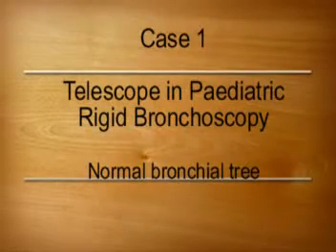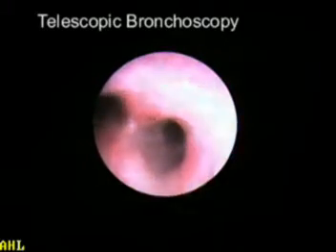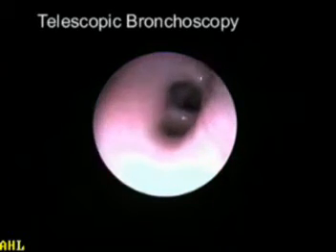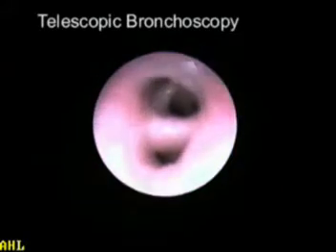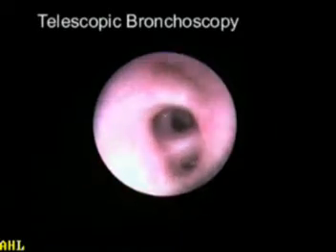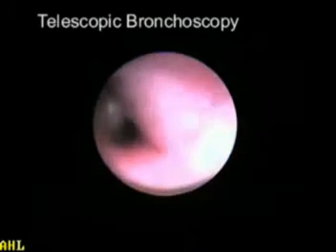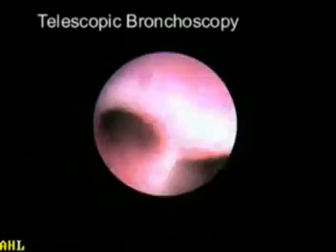A 9-month-old child with respiratory distress undergoes bronchoscopy. The telescope is passed under general anesthesia to inspect the bronchial tree, showing the carina, right bronchial tree, right upper lobe bronchus, middle lobe bronchus, and lower lobe bronchus with its basal segments. The scope is withdrawn to the carina and reinserted into the left bronchial tree, showing the upper lobe bronchus and lower lobe bronchus with all segments.